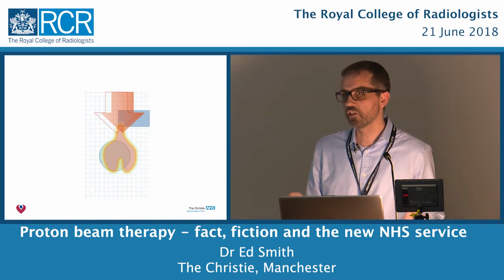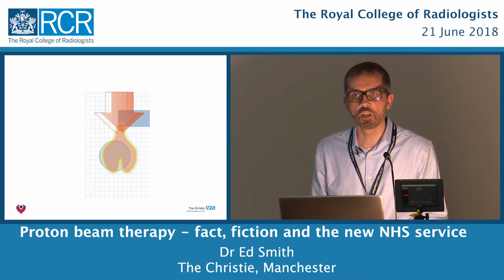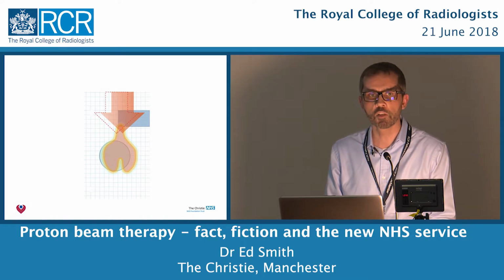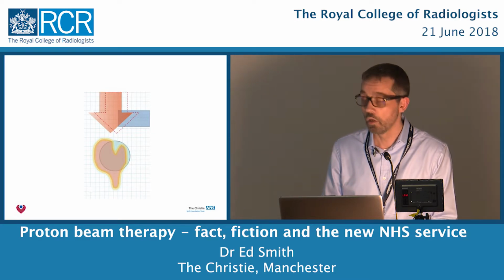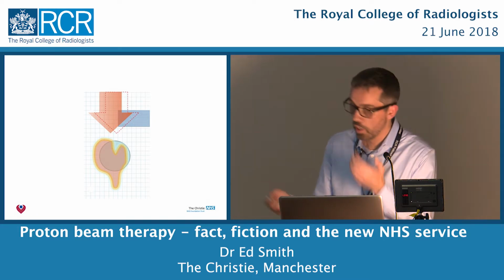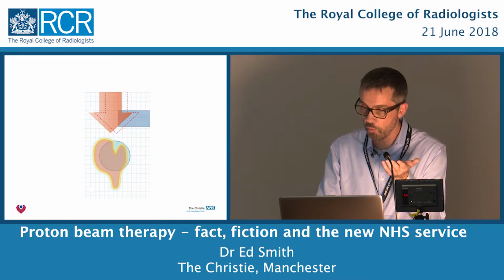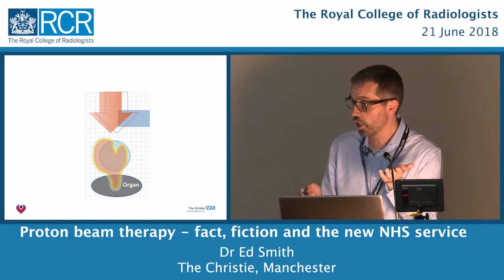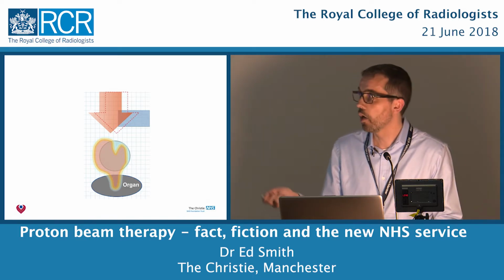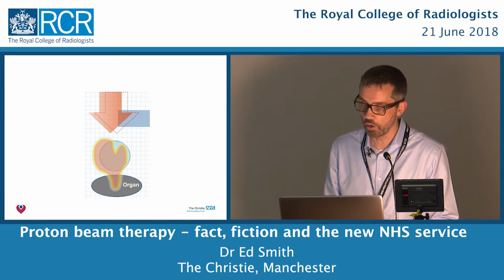So there's two problems there. Firstly, you're not actually fully covering this tumour anymore. And secondly, you're actually giving dose to normal tissue that you hadn't perhaps anticipated. Equally, it could be the other way. The beam moves in the opposite direction with respect to the bone. So you've got those two problems, and it's especially a problem if you've got an organ that you're worried about sitting next to the treated volume.